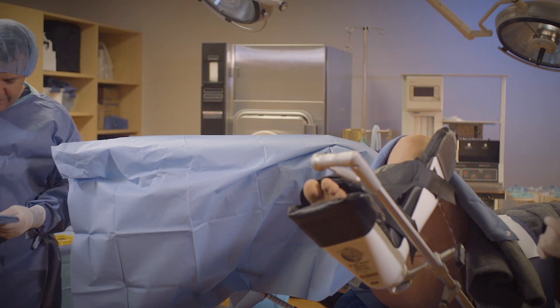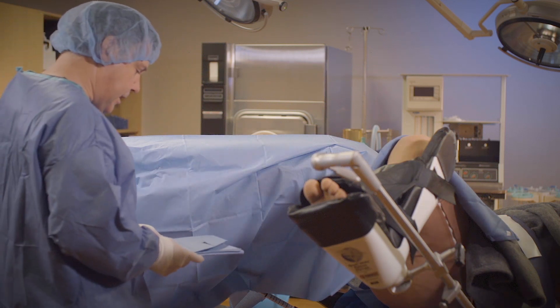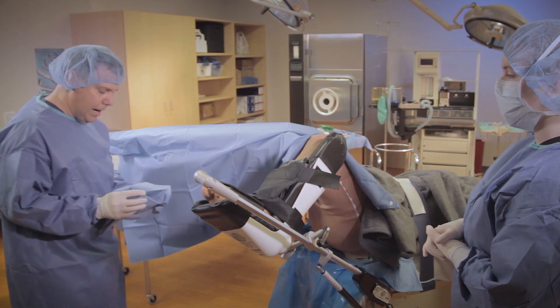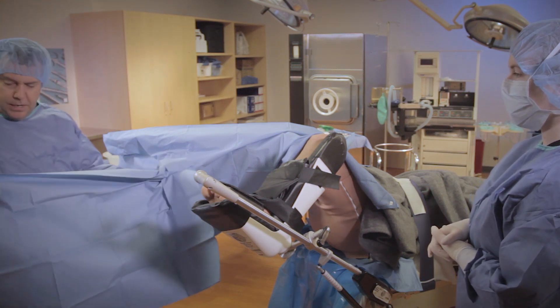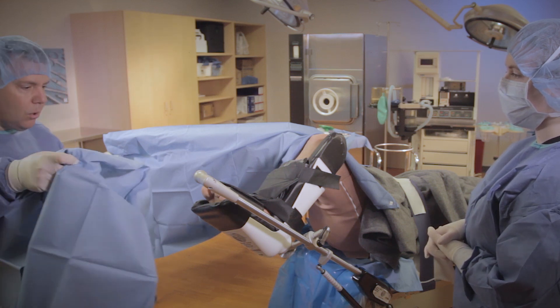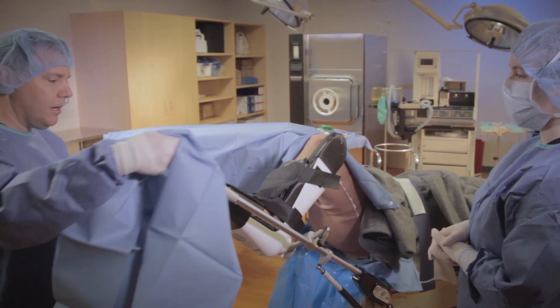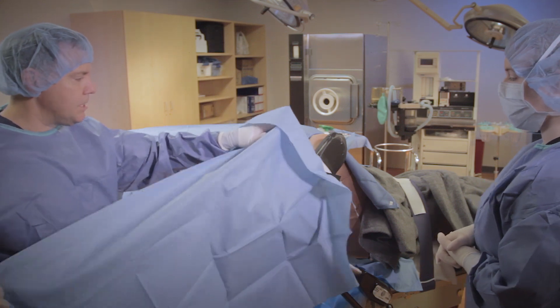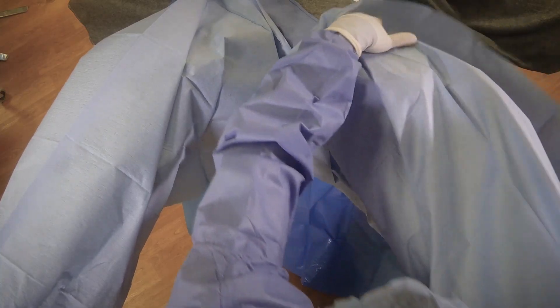Now the next drape. Again, left hand under the cuff and toe. So I'm going to put my hand there, grab the toe, and put my right hand under. It's important to go slow and stay behind the cuff so that we get it completely on the stirrup and we don't contaminate. There we have it — not too shabby.